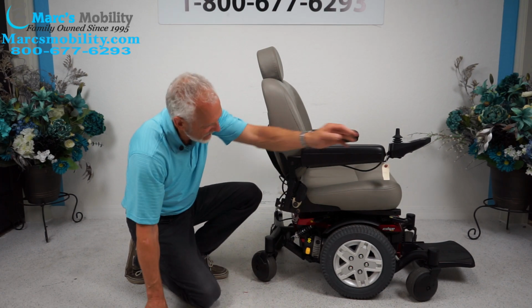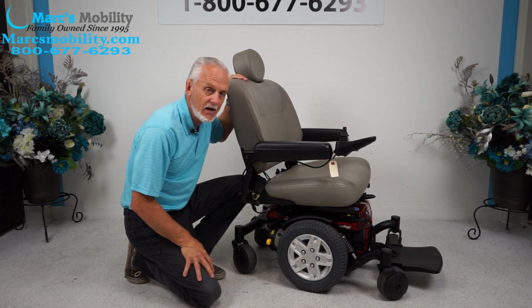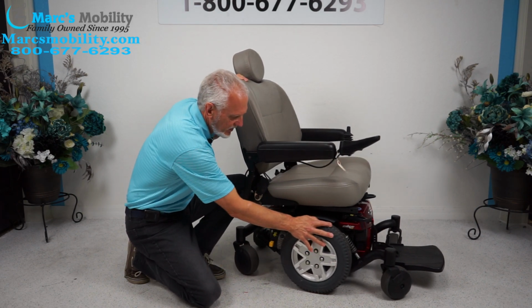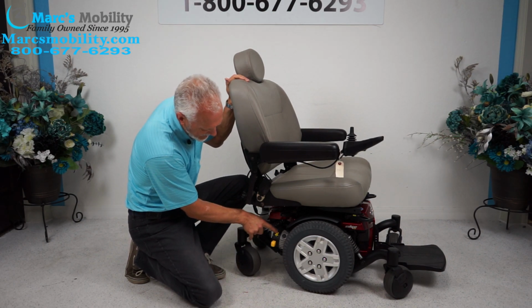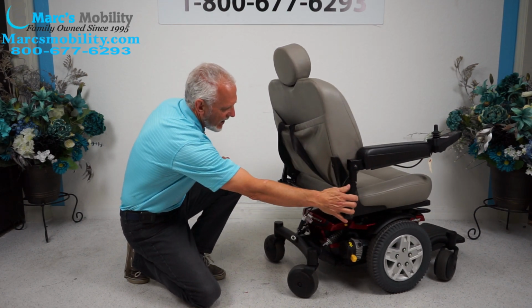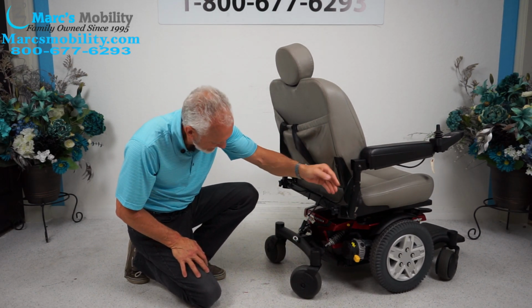You also have, if you want to put it in neutral, what you would do, because right now the chair, the way it is, it probably weighs 300 pounds. So you're not going to be able to lift it. And you can't push it because it's in gear. But if you turn the power off, this is your neutral lever, the yellow lever, and it tells you right here which way it should be. So if you want to unlock it, push it that way. And now you're in neutral. You can see the wheel freewheeling. You have a motor on both sides. So do both motors, okay?